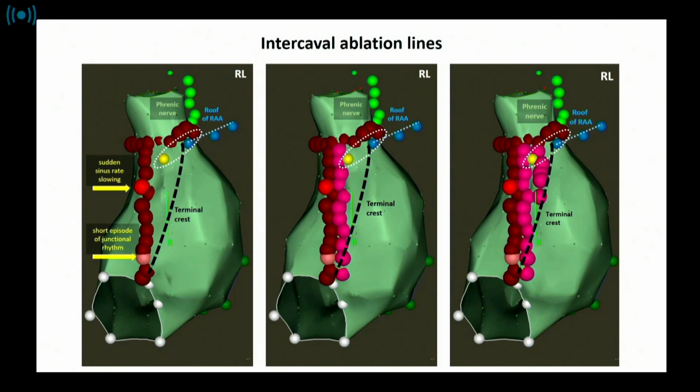And so, because there was not enough drop-off in sinus rate, we continued the second line, and there was no effect at all. And we continued with, again, you see on the right-hand panel, the third incomplete line, and there was no additional effect. But during the infusion of isoprel of 3 micrograms per minute, sinus rate was significantly slower. Let's say we started at 130 per minute or 135, and we ended up with 100 approximately, and it went even lower when we stopped this infusion.